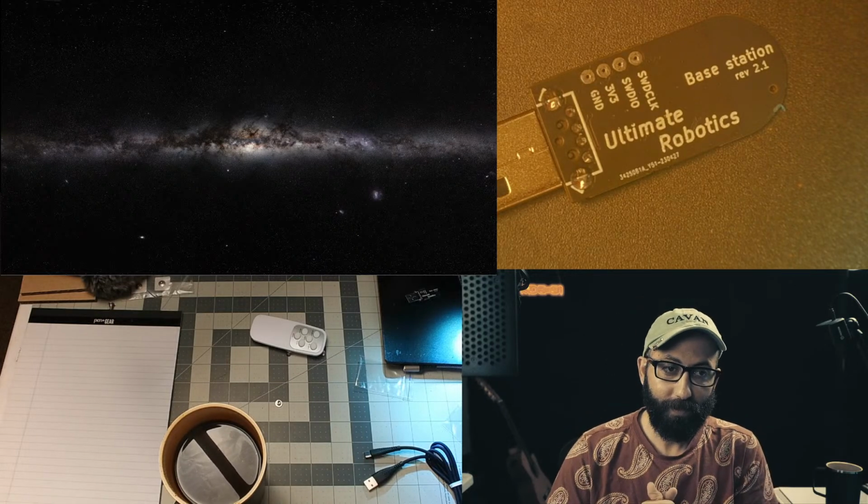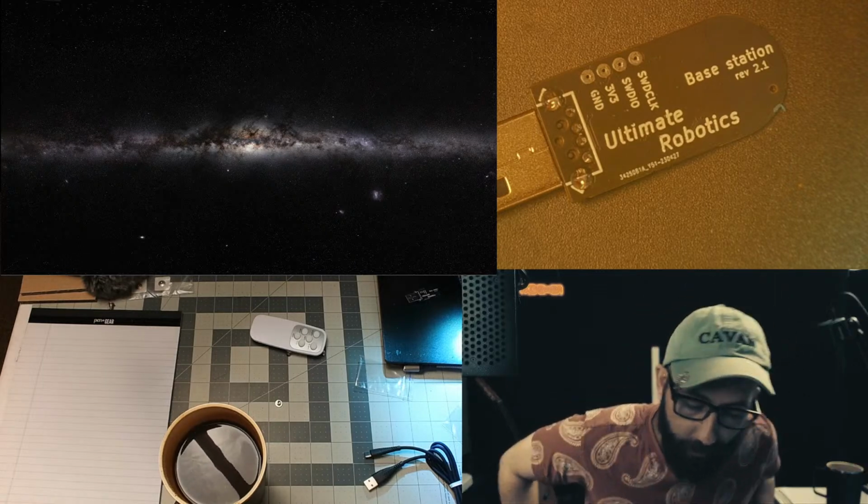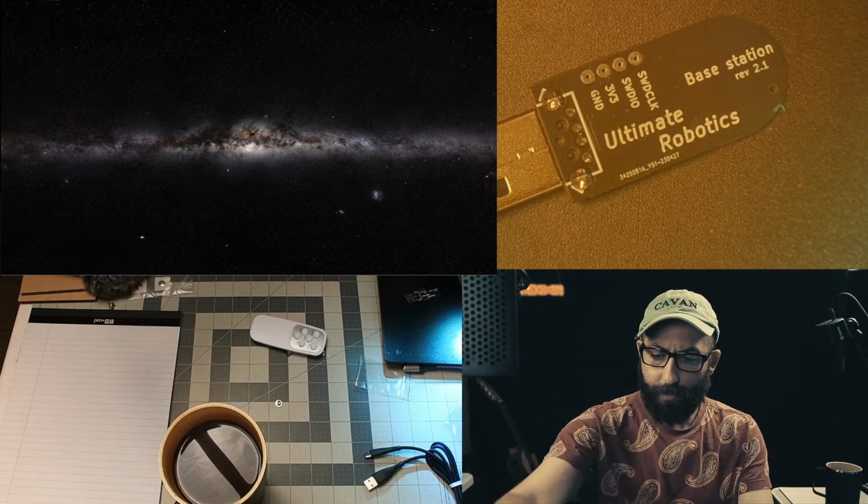Okay. Starting another live stream for uMyo, the machine learning side of things. Last time we did some prep work with uMyo, and I took some of the code that I got done for OpenMuscle, and we're going to be using the same type of machine learning, which is a random forest regressor. In order to do that, we're going to have to get some stuff done first. So today I'm going to just stream the progress that I do, trying to consolidate some code, work on it.